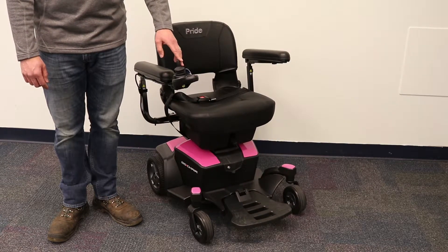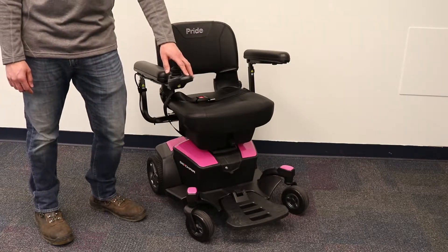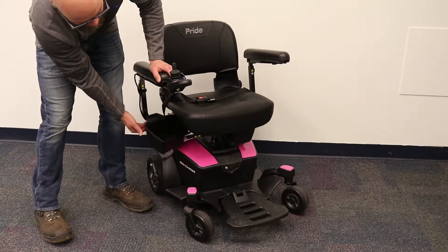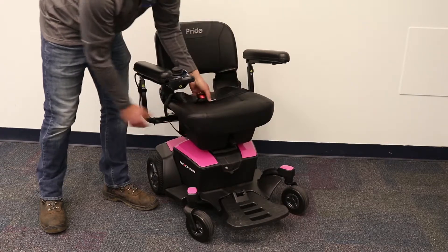This power chair also has a few other features to note. It comes with a glove compartment underneath the seat on both the right and left side. It also has a seat belt and a rear pocket, which is usually where people will keep their charger.